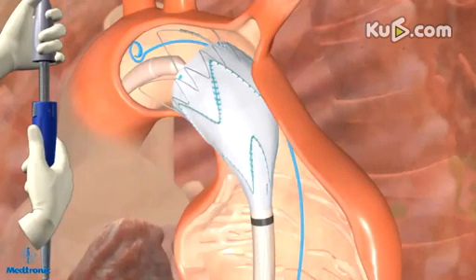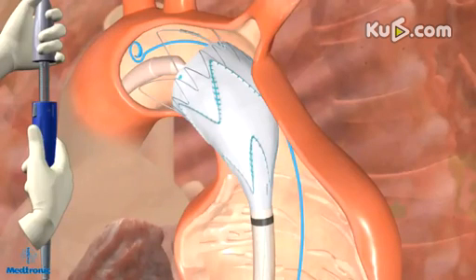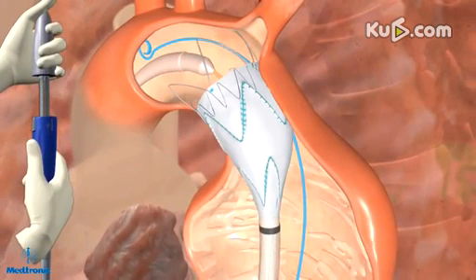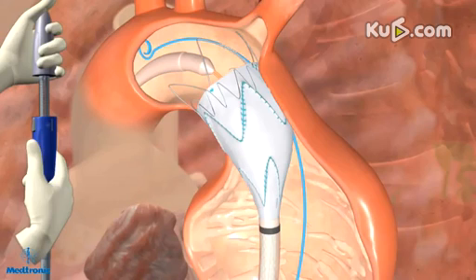If the stent graft was deployed higher than the targeted landing zone, the stent graft can be repositioned distally to its desired location by retracting it, as long as no more than two of the proximal springs have been deployed. To retract the partially deployed stent graft, gently pull down on the entire delivery system until the proximal markers indicating the top edge of the fabric are at the desired position. Do not advance the Talent Thoracic system with an exposed proximal spring, as it may lead to aortic perforation.